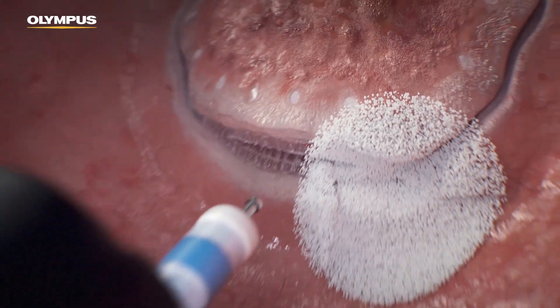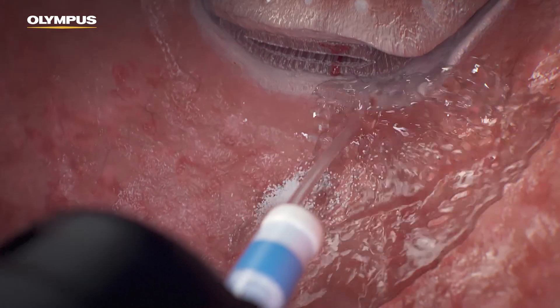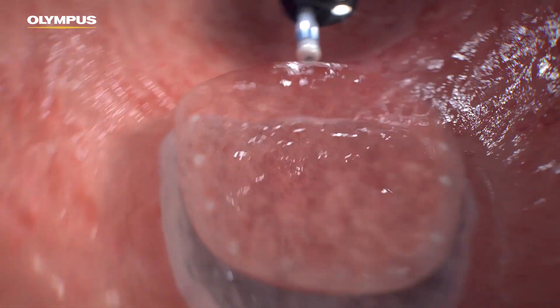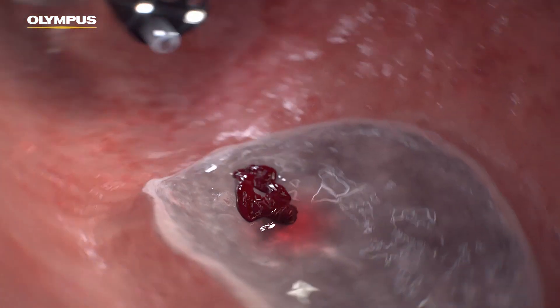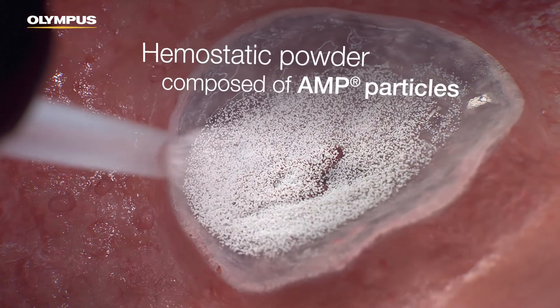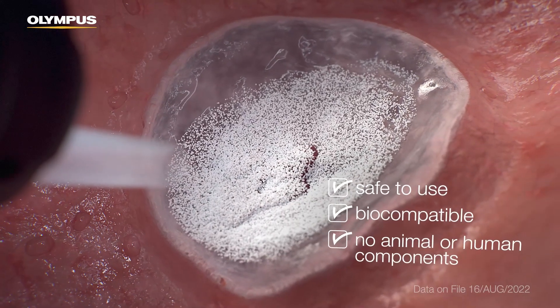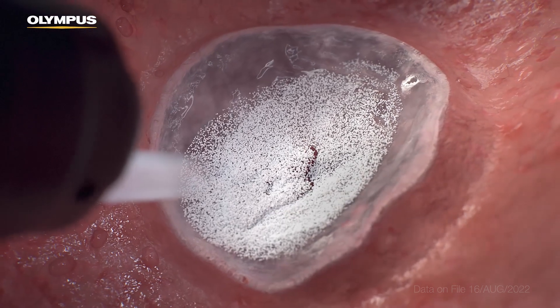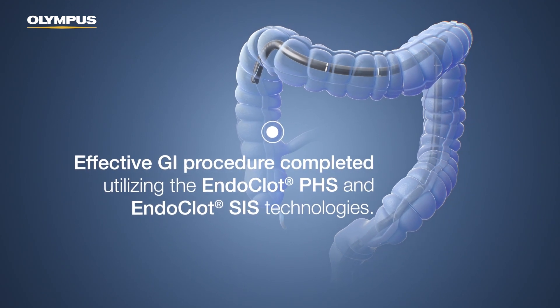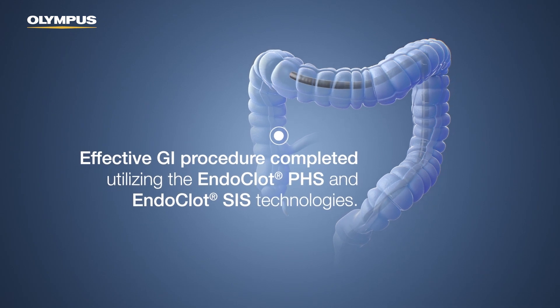If needed, EndoClot PHS can be irrigated after hemostasis has been achieved to verify all the bleeding has been resolved. The hemostatic powder is composed of absorbable modified polymer, AMP particles, is safe to use, biocompatible, and does not contain any animal or human components. An effective GI procedure has been completed utilizing the EndoClot PHS and EndoClot SIS technologies.